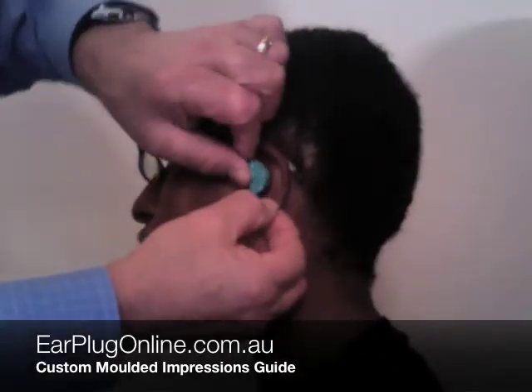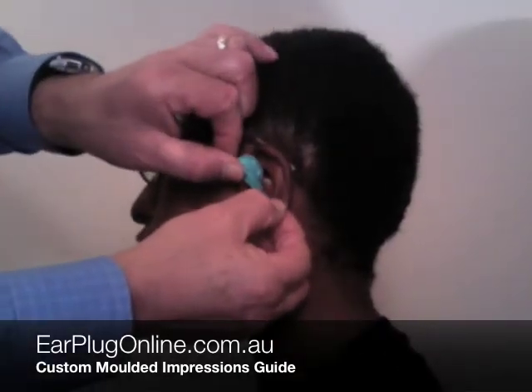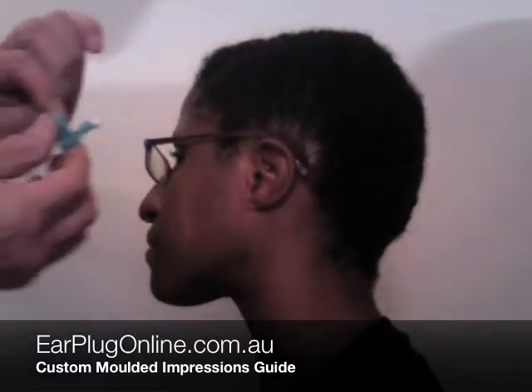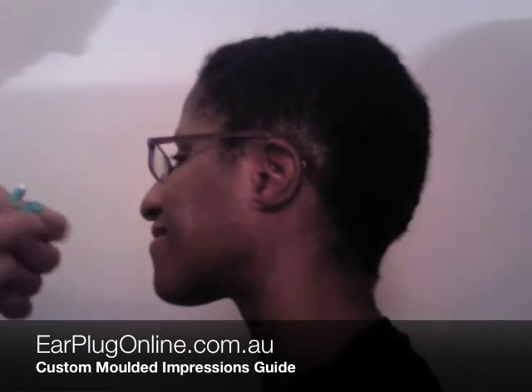The impression is then removed and examined. It is essential that the impression extends past the second bend of the ear canal. This ensures a good seal, giving a high performance ear plug.